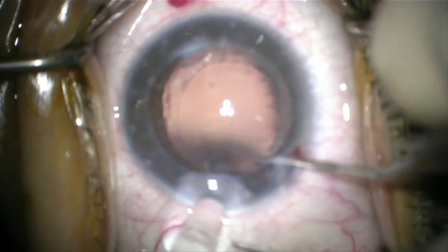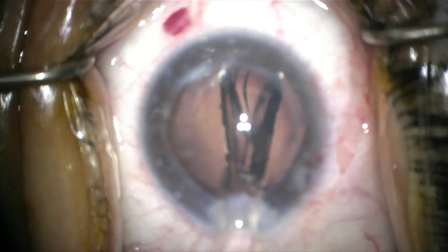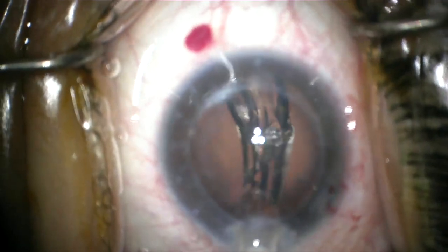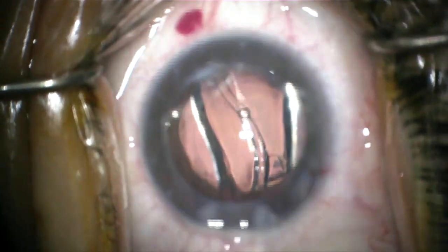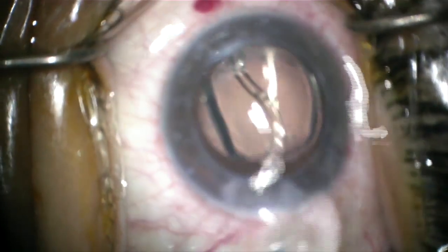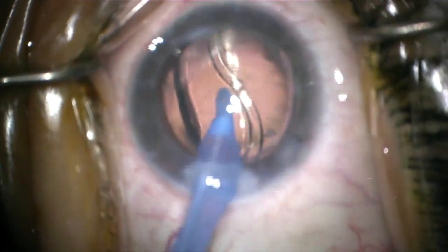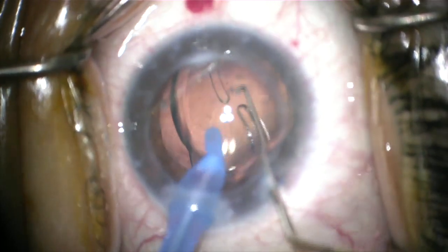I like to use an angled McPherson to provide counter traction. This is the pre-loaded Tecnis lens — I find they inject fairly well. You can center the lens using the injector as well. Sometimes with these pre-loaded lenses the haptics tend to stick together. I find that when I go in to remove the viscoelastic, just a gentle nudge on these haptics, sometimes even with a second instrument, will help to let them unfold.